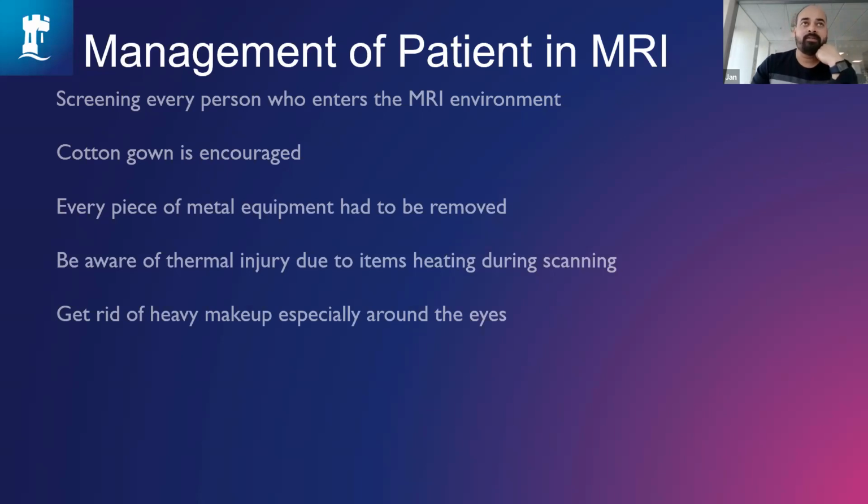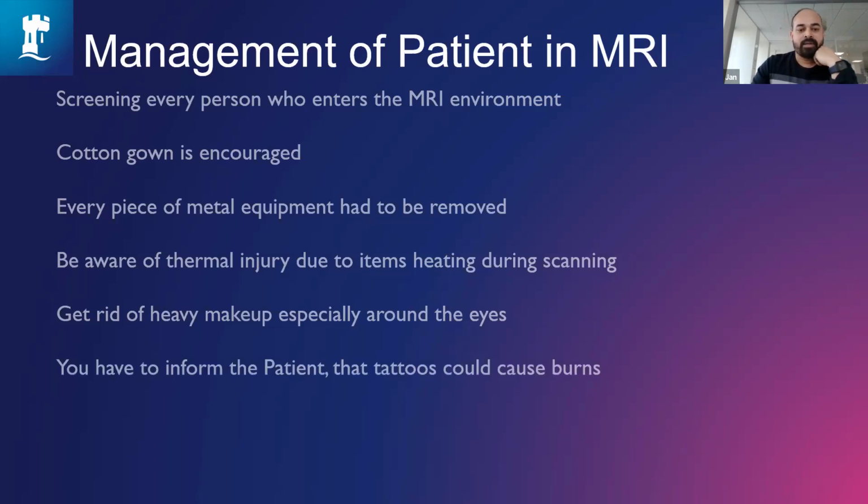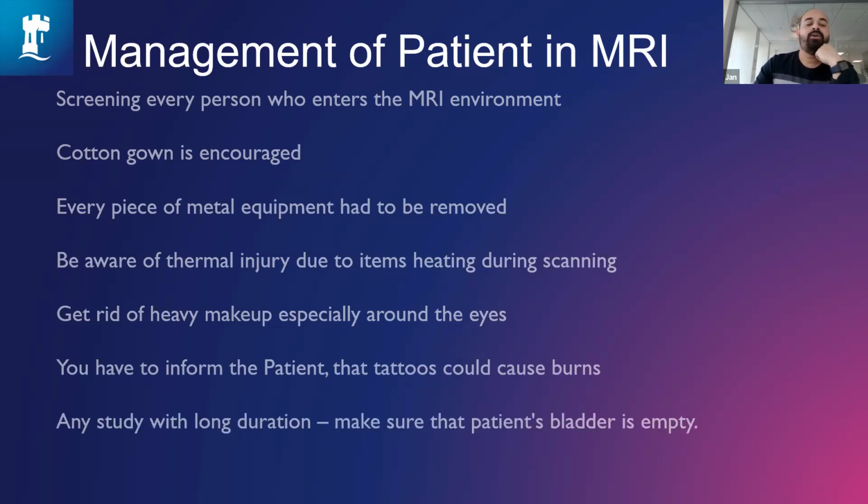In some cases, you also have people turning up with colored lenses, and some of them have pigments. So I also recommend chatting to them about whether they use colored pigmented lenses. You have to inform patients with tattoos that they could burn, and if it's warming up, they should press the buzzer to get off the scanner. For any study with long duration, you should make sure that they have emptied their bladder well before they go for the study.